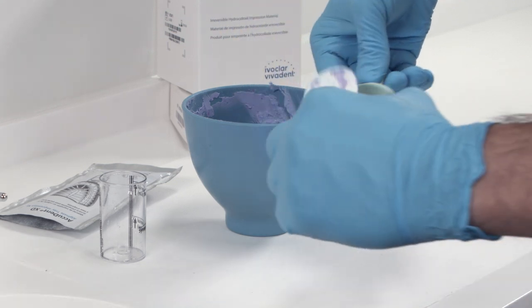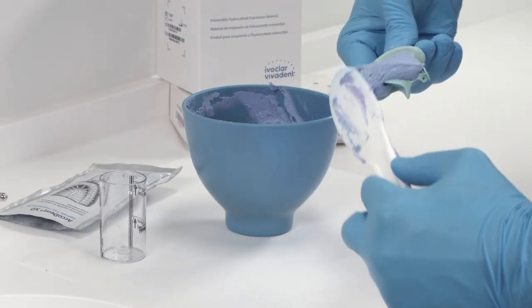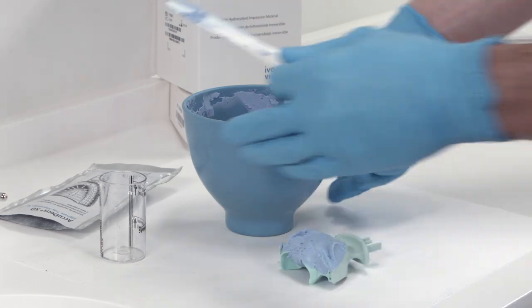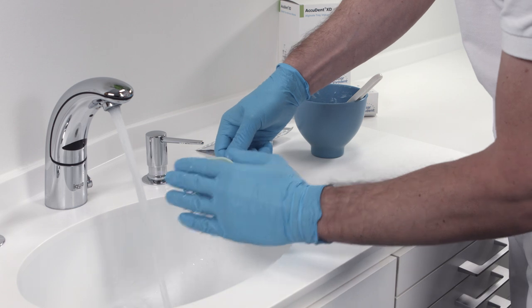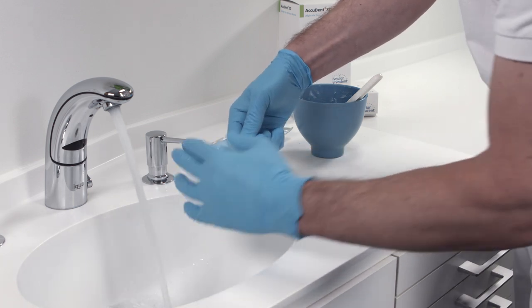Next, apply the mixed impression material to the centric tray. Create a slight mound in the upper jaw. In the lower jaw, build up a shallow ridge and shape it with the help of some cold water.